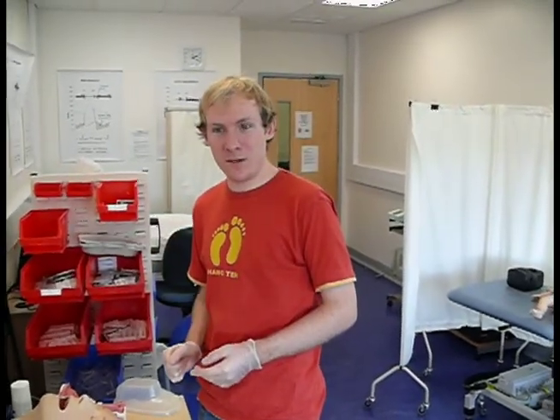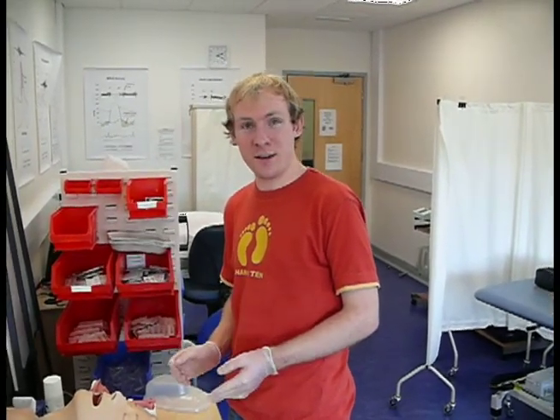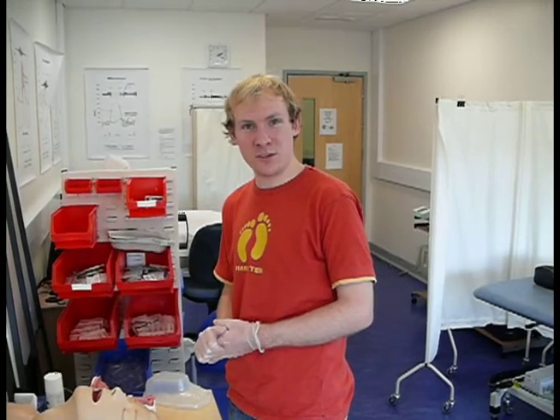Hi, my name is Matthew and this is Harriet. We're in the self-directed learning lab of the clinical skills department and we're just practicing putting in a laryngeal mask airway.